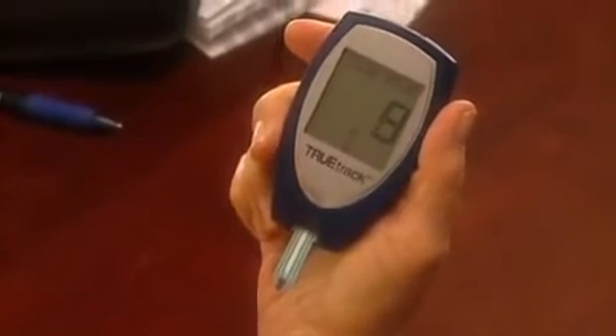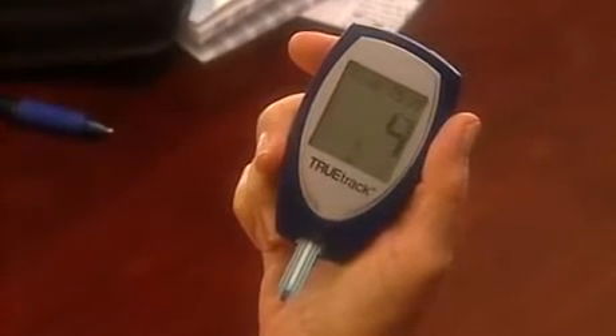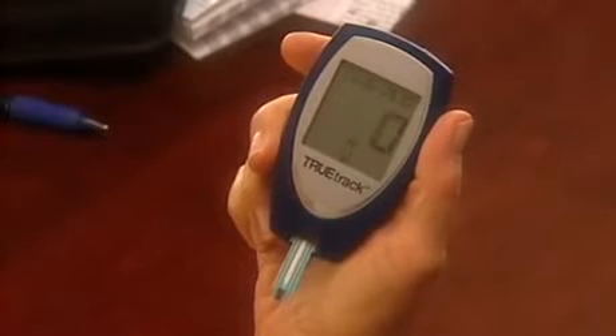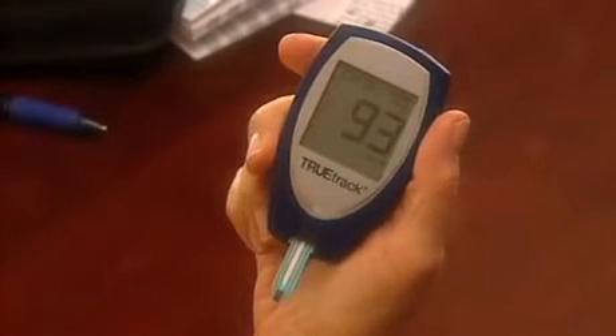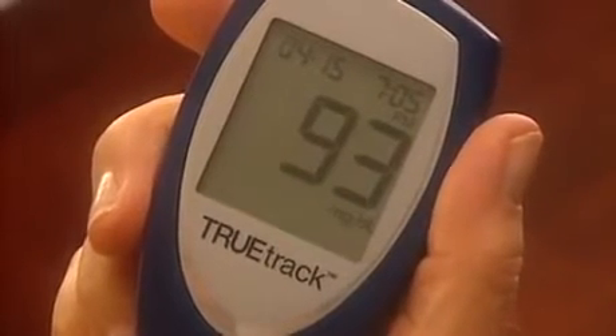The meter will begin to count down from 10 seconds to zero. Be sure to apply the blood sample to the tip of the test strip and not to the top of the test strip. Within just a few seconds, the glucose result is displayed along with the date and time.